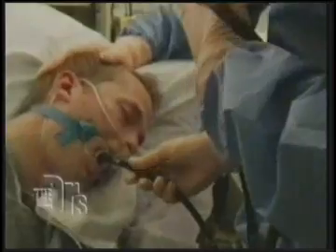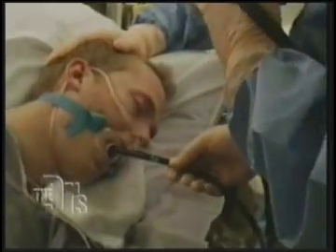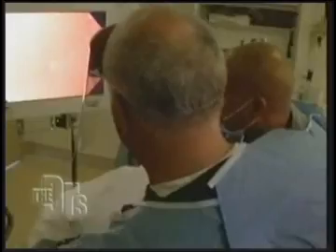So there we are in the esophagus, and you can tell, see this area here in the esophagus? You see lines going up, so he's got esophagitis. So he definitely has reflux. Something is burning that esophagus. All right, that stomach is a little bit irritated. It should be nice and pink. All right, that's not normal.